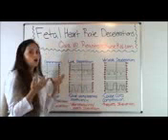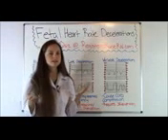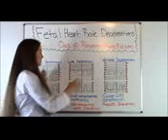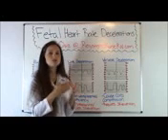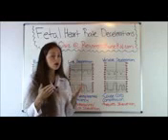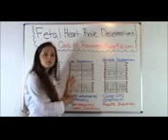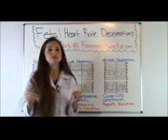So it's confusing between late and early, right? How do you tell the difference? The key to tell the difference on this, whenever you see it, is that with early, whenever mom has a contraction, that's when baby's heart rate is going to respond to it. Because what you're having in this problem with late decelerations is you have uteroplacental insufficiency.